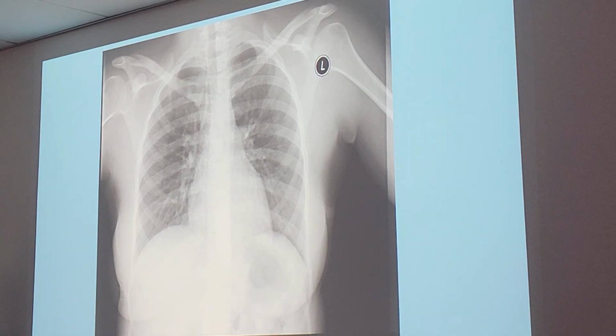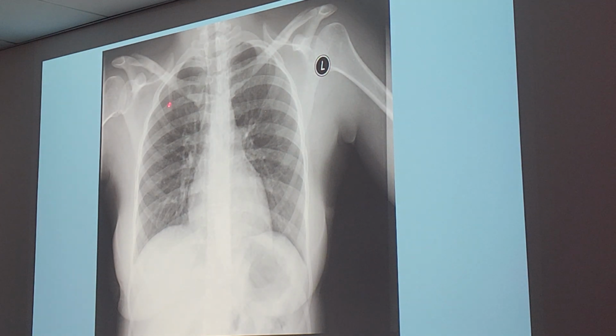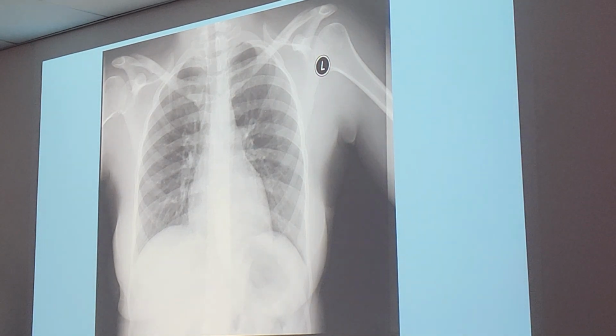Why can you see the scapula on the lung, ma'am? On this side, on the left side. You see this, and then you see this right here. Normally, if your arms were properly out of the way, or doing the chicken wing, it should lift it out of the way. Alright, good job.